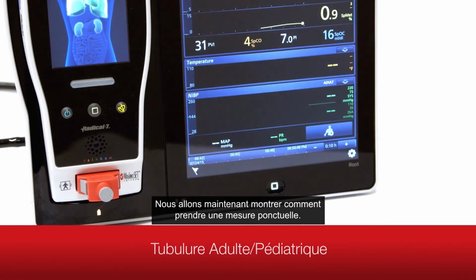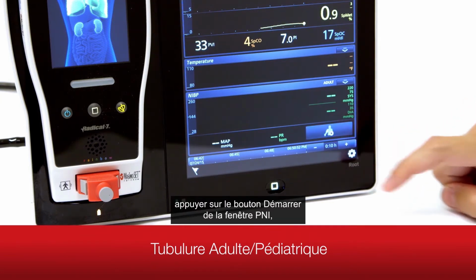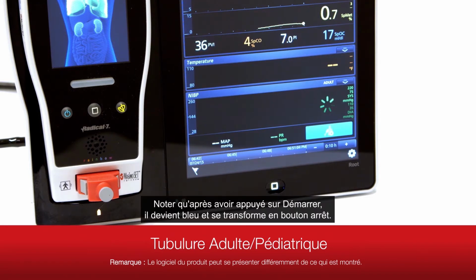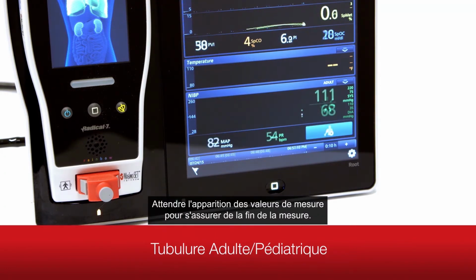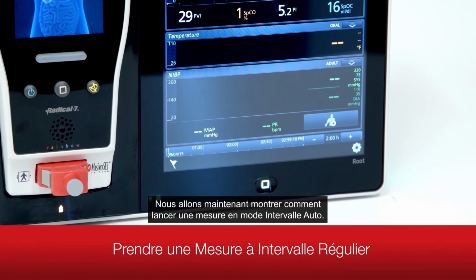We will now demonstrate how to take a spot check measurement. To begin, touch the Start button in the NIBP window. Wait for the measurement to complete or touch the Stop button to abort. Note that after you touch the Start button, it turns blue and becomes the Stop button. Wait for the measurement values to appear to ensure that spot check is complete. We will now demonstrate how to take an automatic interval measurement.